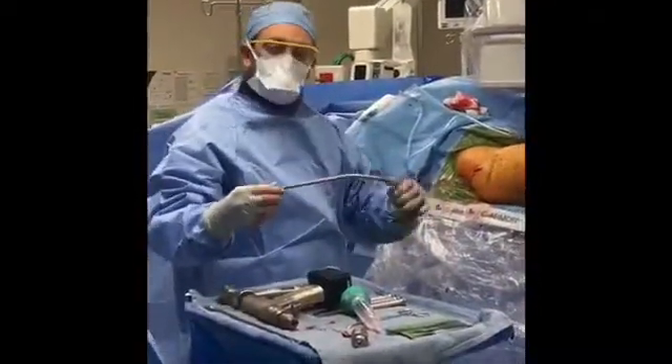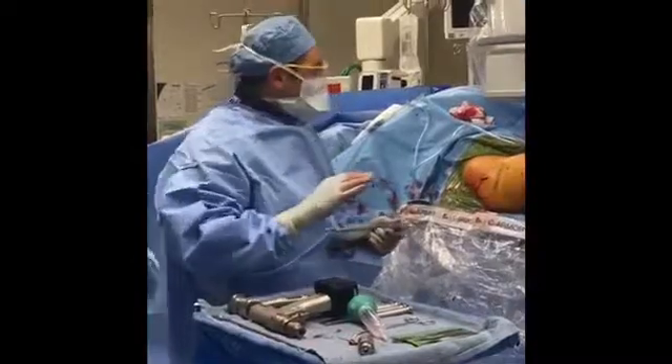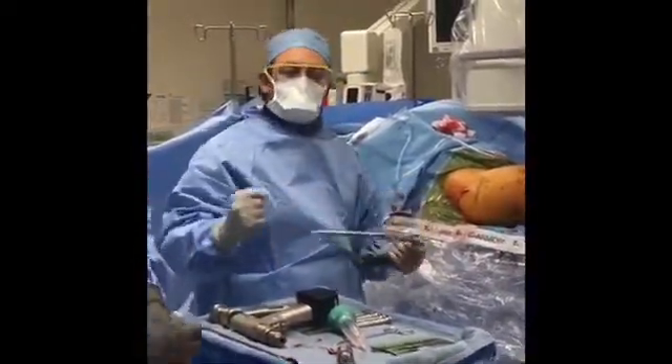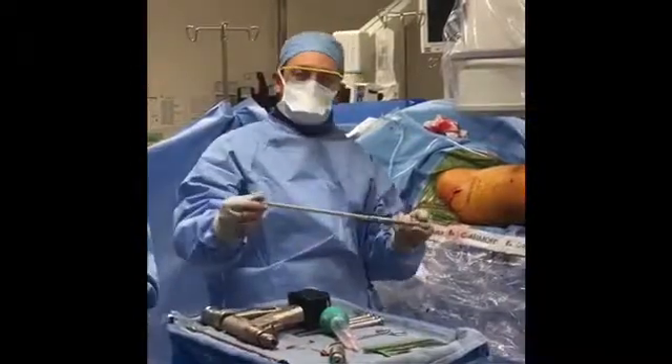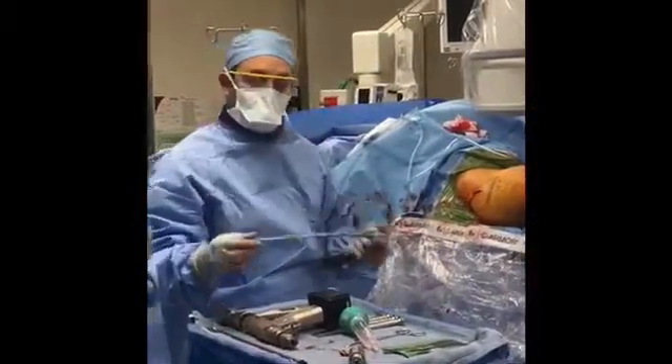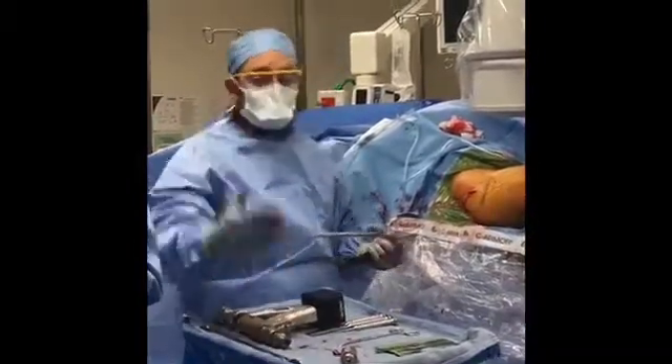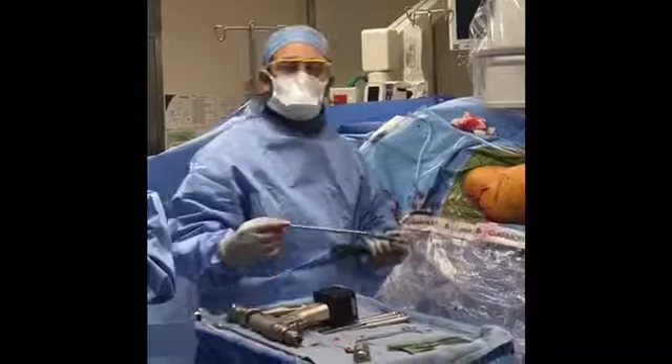So we're gonna put in our nail. The canal is all ready. We're testing out the nail, making sure it's nice and strong. This is our stride nail — it's the 10 millimeter nail, which is still very, very strong. This is gonna go right above the osteotomy site. We're gonna complete the osteotomy and then slide it across.